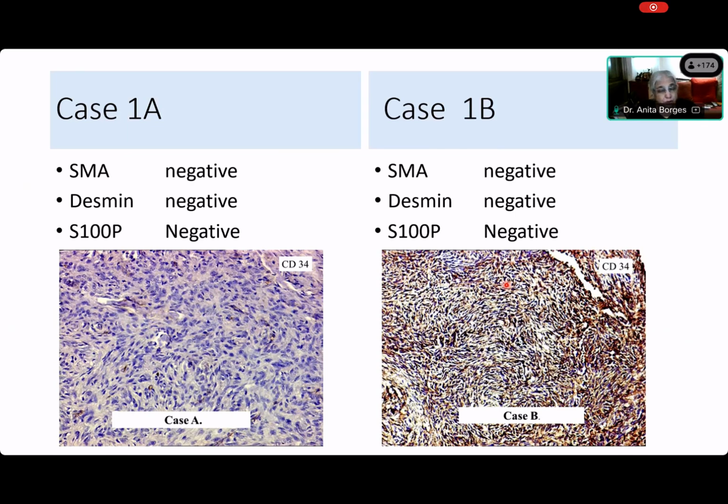Something that is very cellular, you are unlikely to want to call a benign lesion. But this is not something that you should take your chances on. This is something where you need to do immunohistochemistry. And there are 4 major immunohistochemistry markers which, if you are going to investigate any spindle cell tumor, for that matter any mesenchymal tumor, you cannot afford to miss. And what are they? SMA, which is smooth muscle actin, desmin, S100 protein, and CD34.